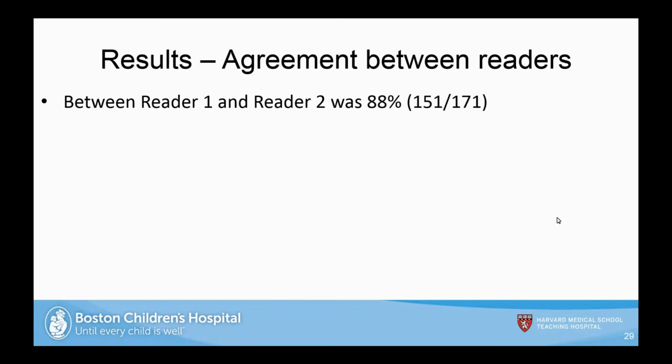Transfer learning is where you develop your algorithm on a really large data set. A lot of people use ImageNet, which has millions of images, and then fine-tune it based off of their data and the application they're trying to achieve. Right. So you have that base neural network to start with, and they just fine-tune it instead. If they did, they didn't specify it. Yeah, that's a good point. Any other questions?